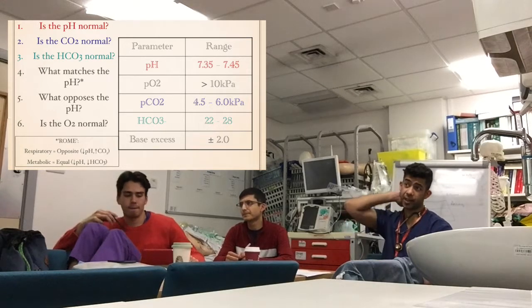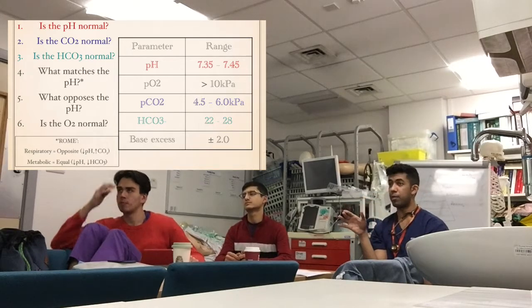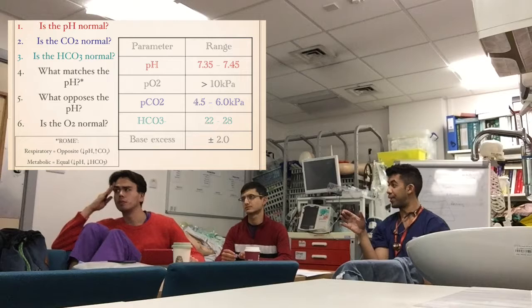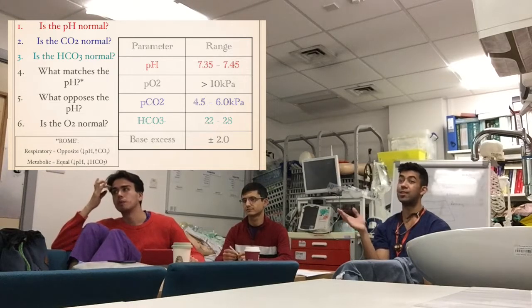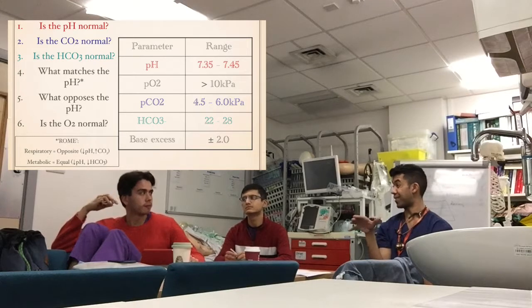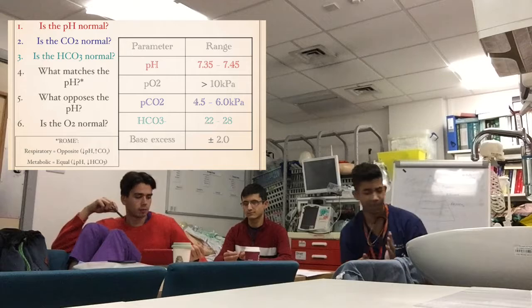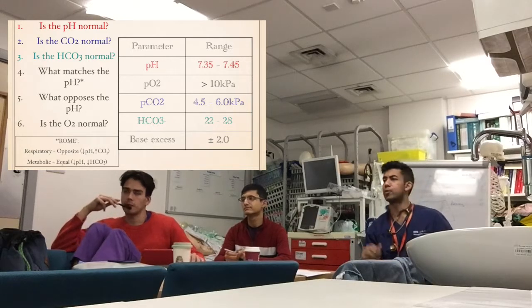Awesome. And then 6 is, is the O2 normal? Because it's all well and good interpreting a blood gas, but if your patient's there gasping for air, with SATs of 82 or something, then you're going to be more worried about them being in respiratory failure, or arrest, along those lines, than wondering if they're having a PE or something. But also that gives you a clue as to whether the problem's respiratory. Is that okay? All right.